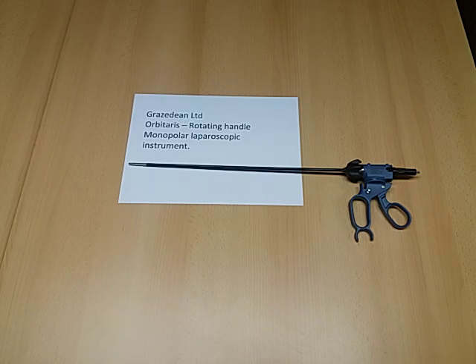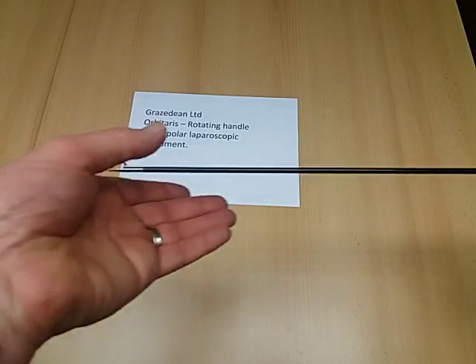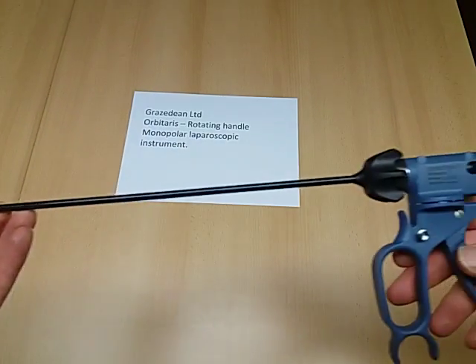This is the Orbitaris monopolar 5 mm diameter instrument. It has a range of 10 different electrodes that are interchangeable with the single handle.